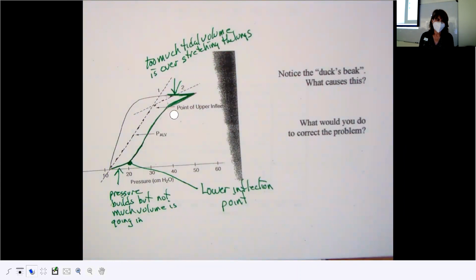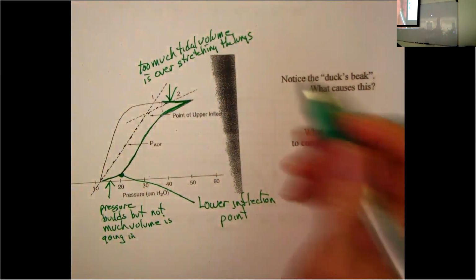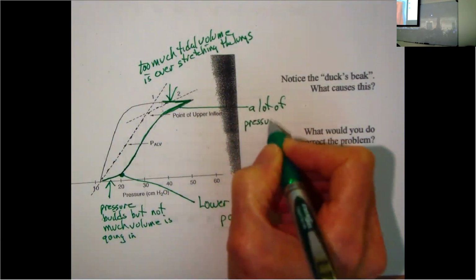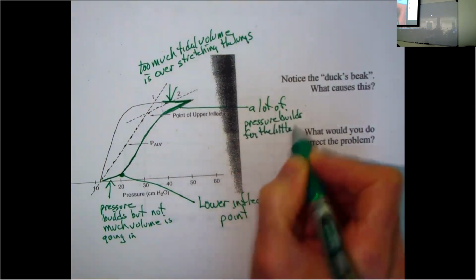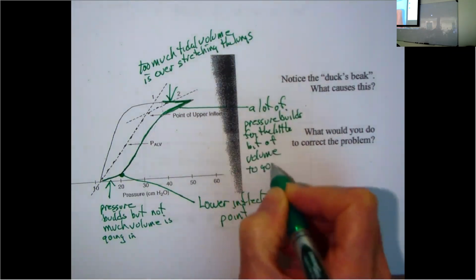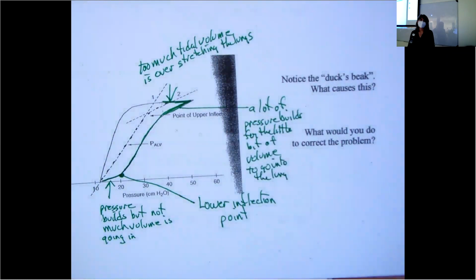A little bit of volume, but a lot of pressure builds up when you put that into the lungs. A lot of pressure builds for the little bit of volume.